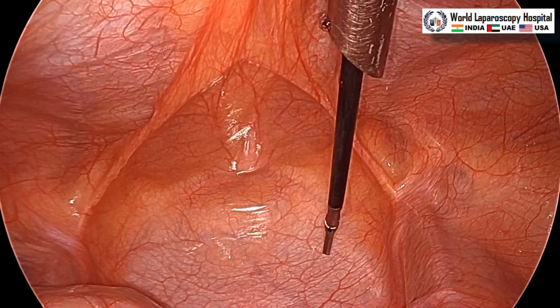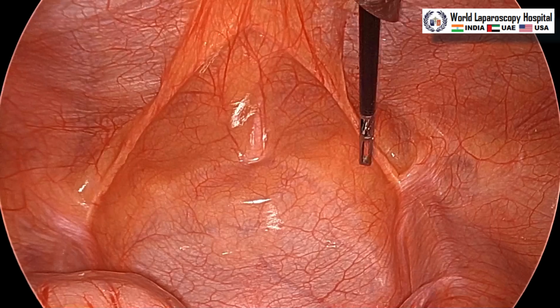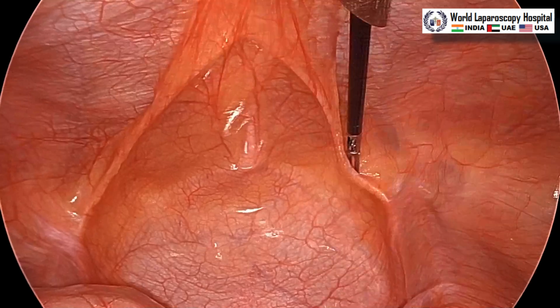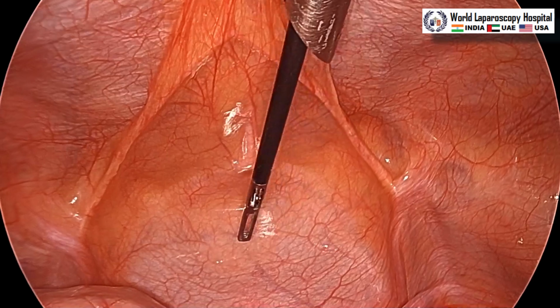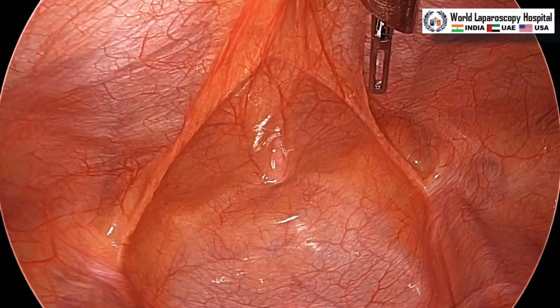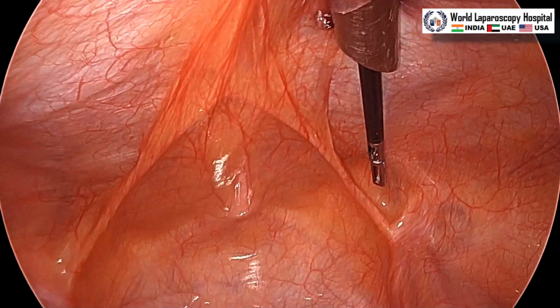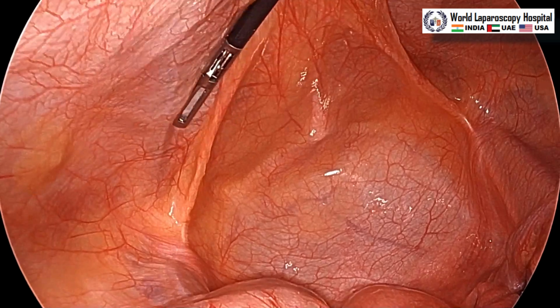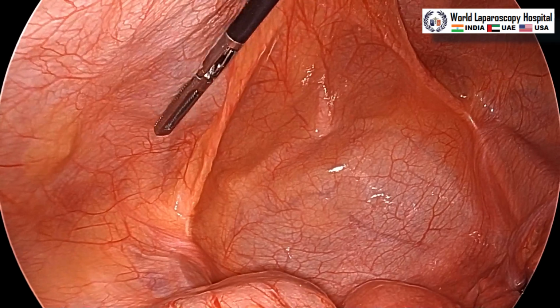That is why in hernia surgery also you should never sharply cut medial to the medial umbilical ligament, because this area belongs to the bladder. So this direct hernia, if it is there, will be here, and an indirect hernia will be lateral to the inferior epigastric vessel. Now this is the inferior epigastric vessel, that is the lateral umbilical ligament of the right side. This is the inferior epigastric vessel, and this is the inferior epigastric vessel of the left side. This one is also called the lateral umbilical ligament, that is the inferior epigastric vessel.